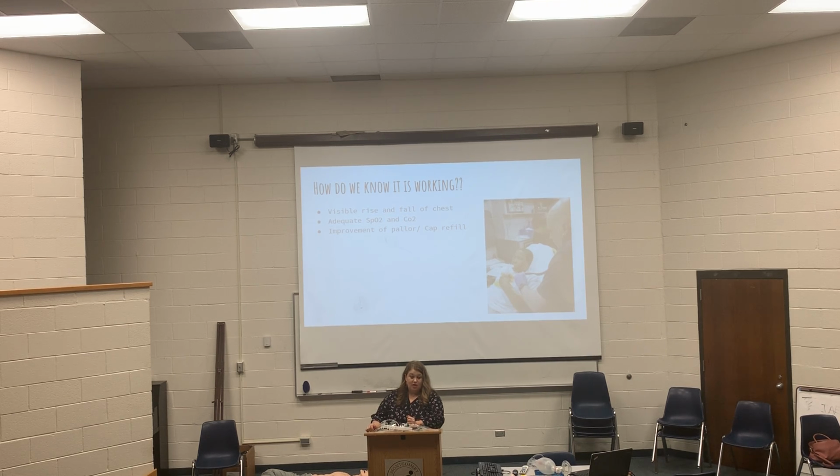So if you don't see that, you can suspect that, and again, you guys won't decompress, but it could come down to decompression. But that's a good way to know, like when we worked last week with the mannequins, you want to see those lungs inflate, you'll see that chest rise, adequate SpO2 and CO2.